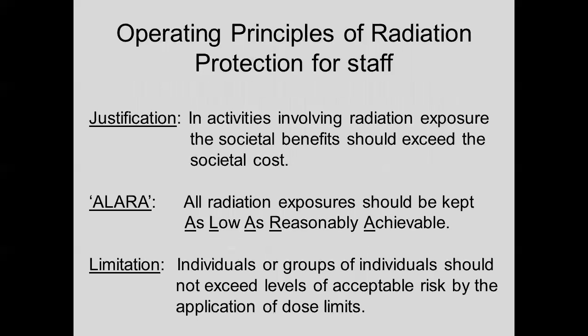So once again, operating for staff, justification. The activity should benefit society somehow. So by doing cath, are we benefiting society? Depends on who you ask. Awesome question. Depends on who you ask. When you do it, are you using the lowest amount of radiation possible, and are you taking as many precautions as you can that are reasonable? And limitations. Once again, we have to set a limit somehow where we say the risks you're taking because of your occupational exposure far exceed what they should.